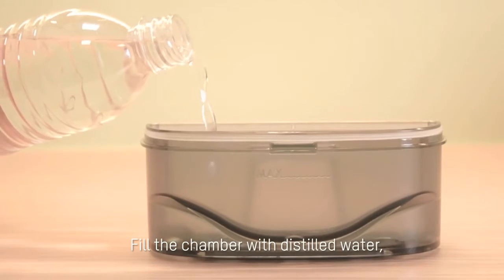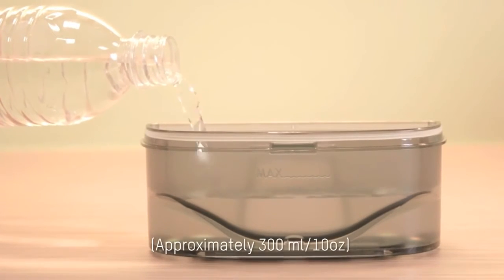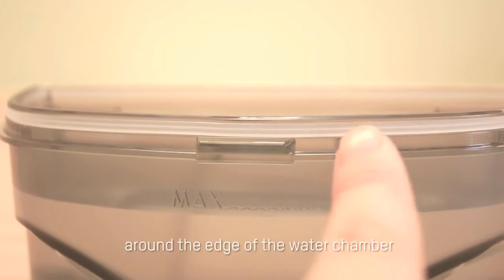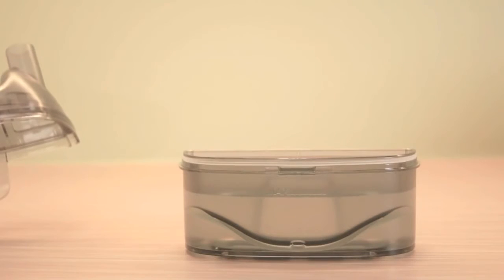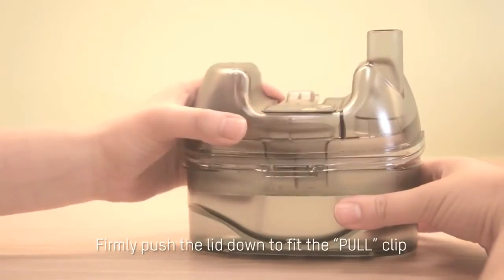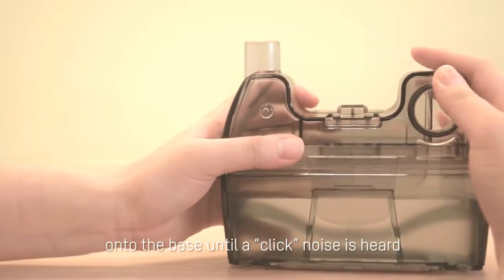Filling the Water Chamber. Fill the chamber with distilled water, but do not fill it over the max line. Check to ensure the silicone seal fits properly around the edge of the water chamber. Buckle the lid and base with the clasps above the max mark.